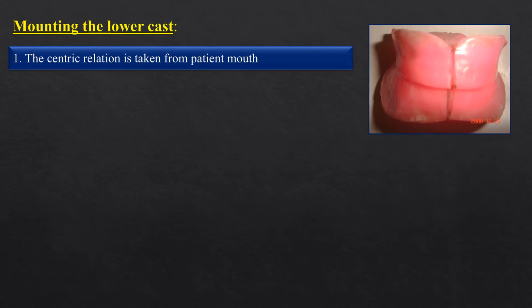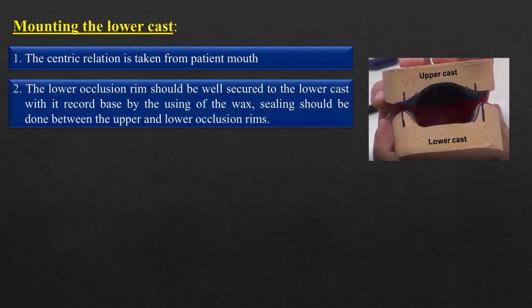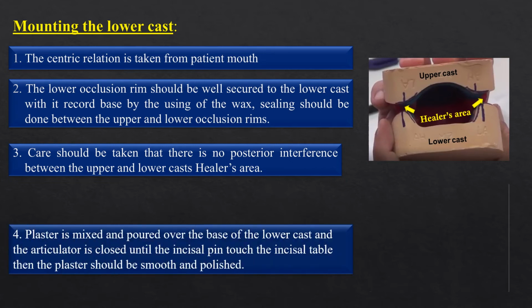Mounting the lower cast. The centric relation is taken from the patient's mouth. The lower occlusion rim should be well secured to the lower cast with its record base by the use of wax. Sealing should be done between the upper and lower occlusion rims. Care should be taken that there is no posterior interference between the upper and lower casts, heel area.